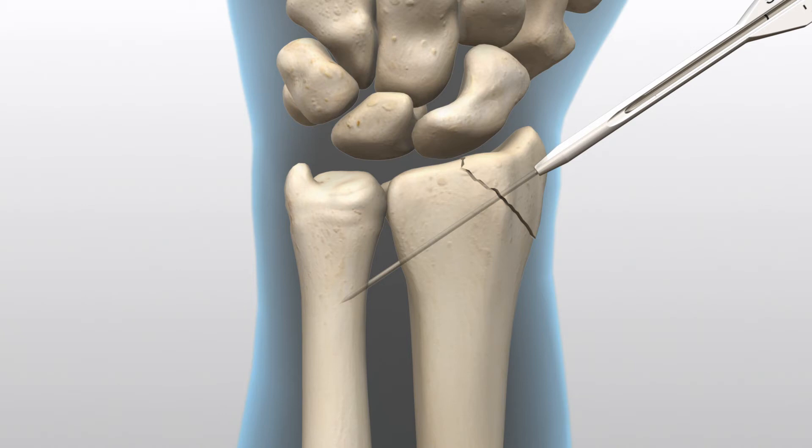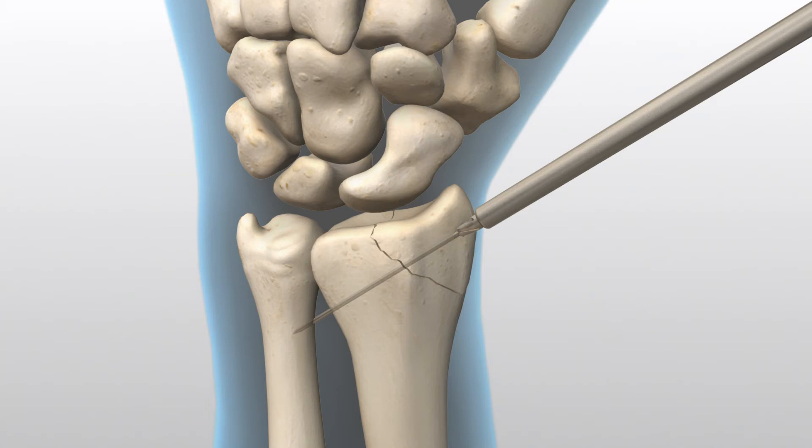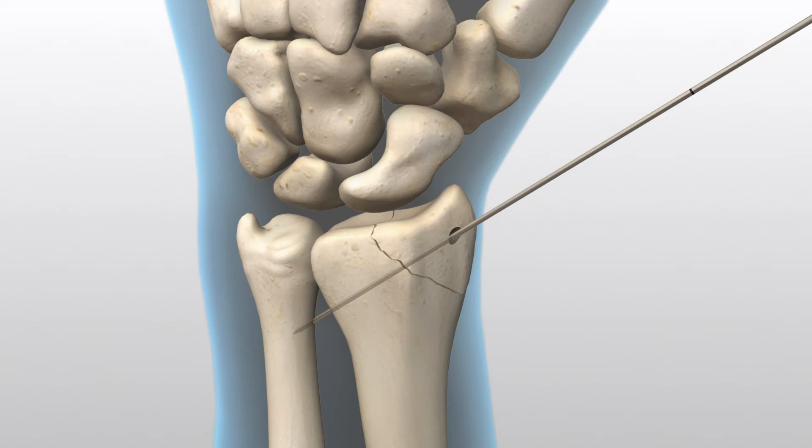Advance the guide wire through the far cortex. Open the near cortex with the Standard Profile Drill. An optional long 3.2-millimeter straight drill is available for use in the distal fragment and helps the screw to engage without distracting in dense bone.